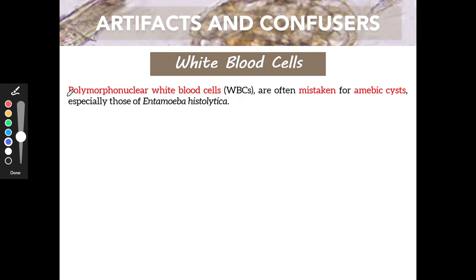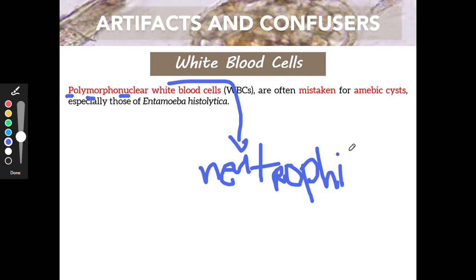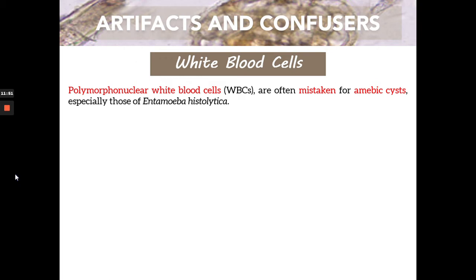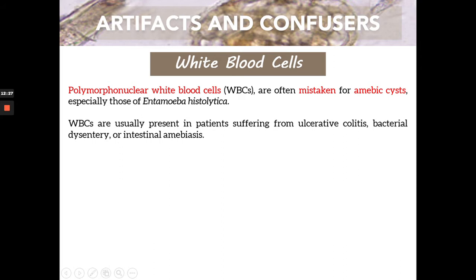PMNs are polymorphonuclears, and usually when we say PMNs we refer to your neutrophils. These neutrophils, if you recall their appearance from your intro to MedTech or HIS, may be mistaken as an amoebic cyst, especially those of Entamoeba histolytica. Their sizes in micrometers are actually close, making it very difficult to differentiate WBCs from amoebic cysts.